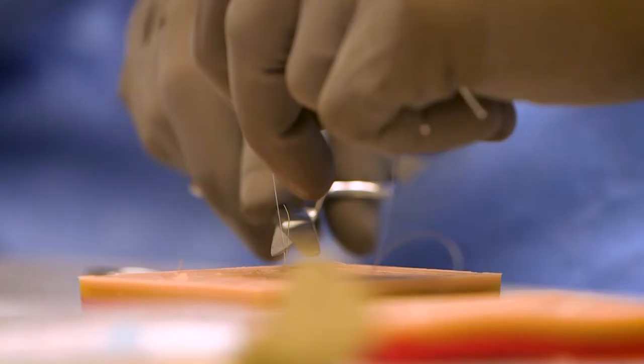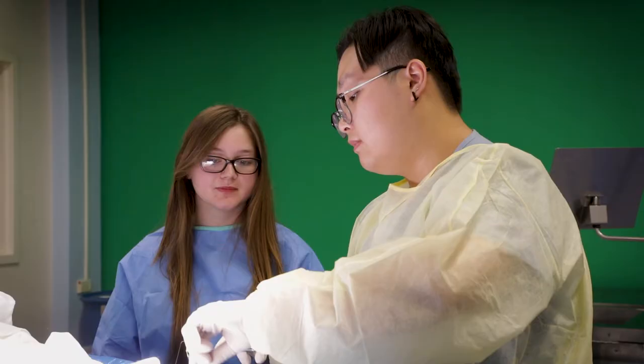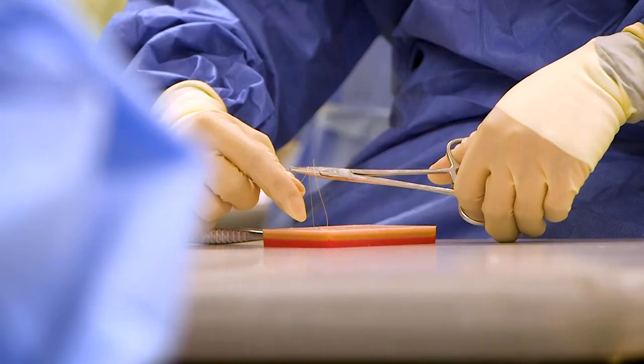Maury High School has their medical program and they brought some students in to learn basic knot tying on the gel blocks as well as hand tying. It's been fun, really enlightening. It's made me consider medical school more. It's been really fun to work with everyone and kind of learn and teach as we go.